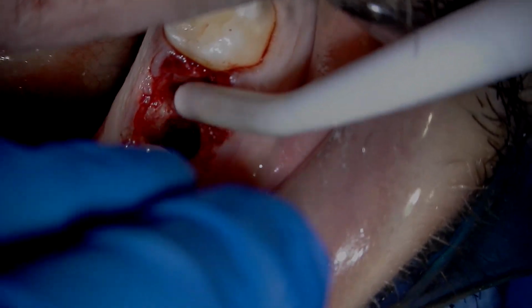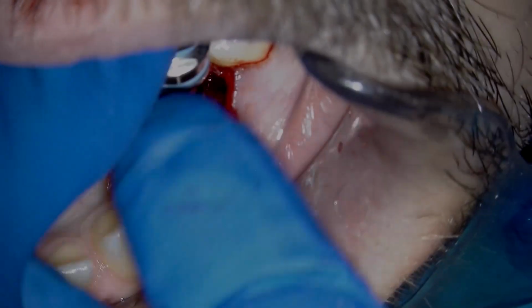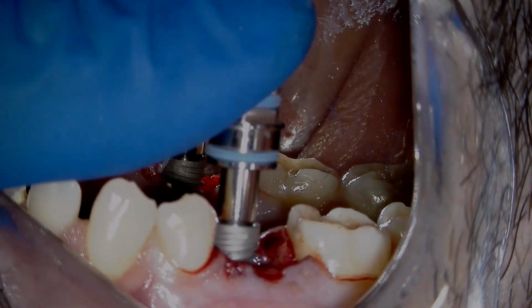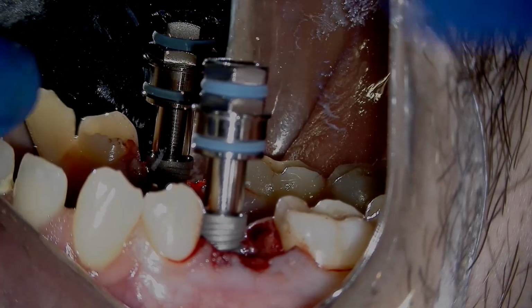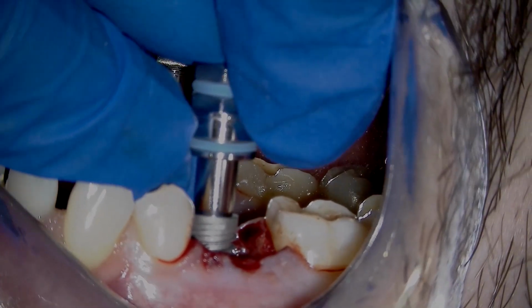The osteoconverter comes with a hand carrier driver, and I'm going to carry that over directly into the osteotomy site, place it in, and then just drive it down with my fingers until it engages the bone to where I get a tug back to remove the hand carrier. So let me just remove this hand carrier here.